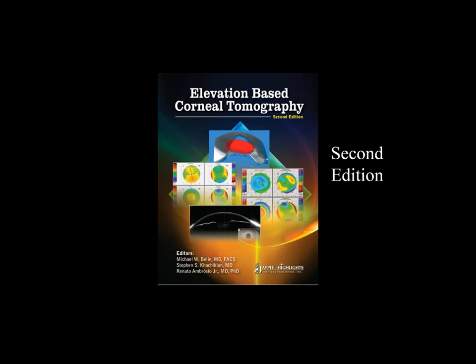And another question here before we wrap it up is, what parameters do you look at on the Pentacam for keratoconus progression? Very, very good question. One that's at the moment the biggest discussion point, and one that's going to be discussed heavily at the ESCRS. I look at changes on anterior elevation, posterior elevation, and corneal thickness. And I need to see changes in 2 of 3 parameters.